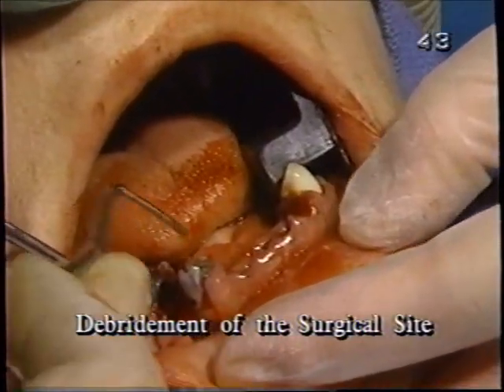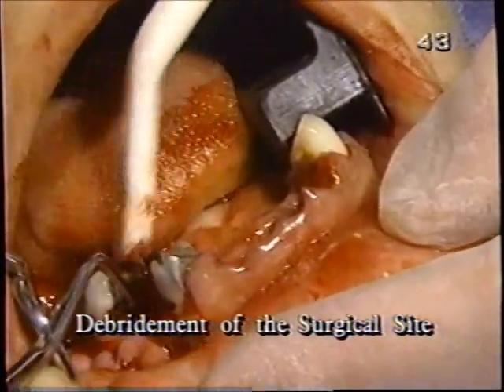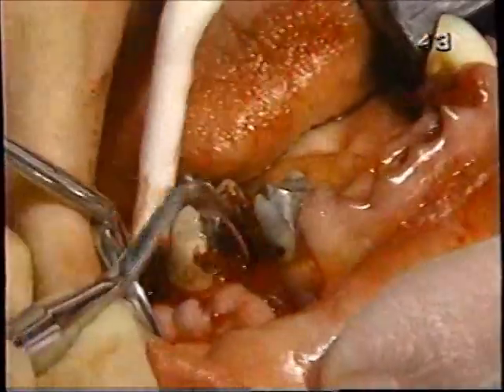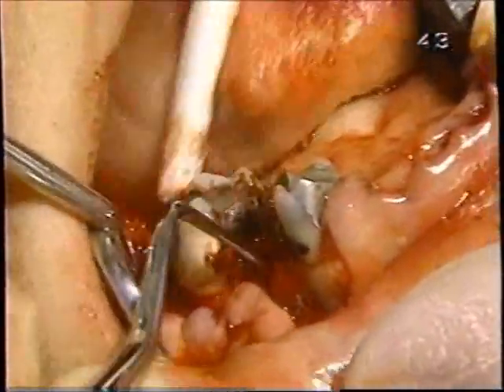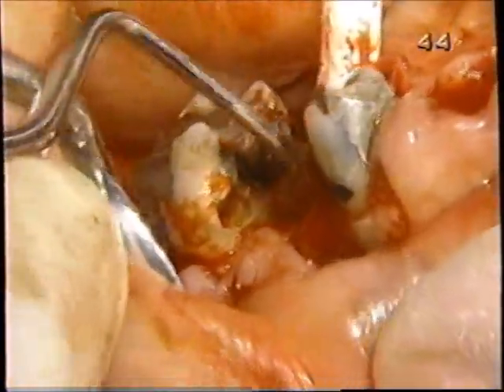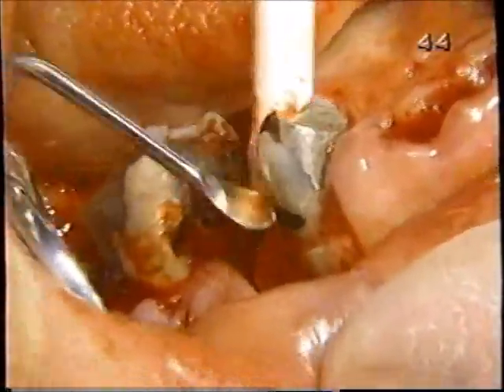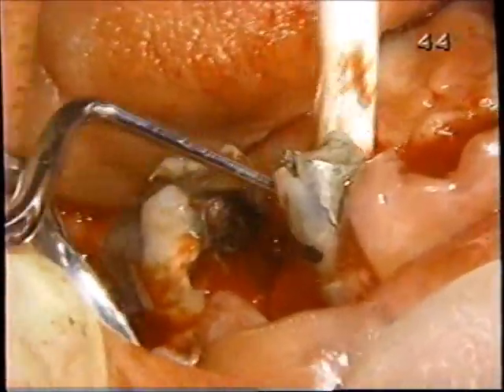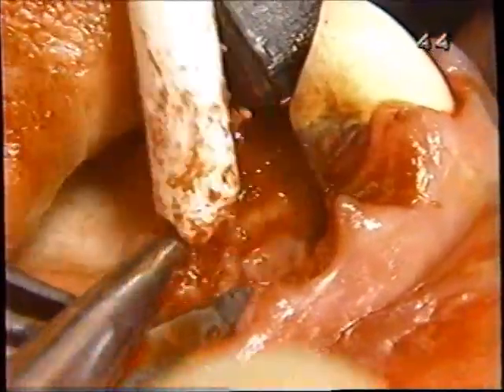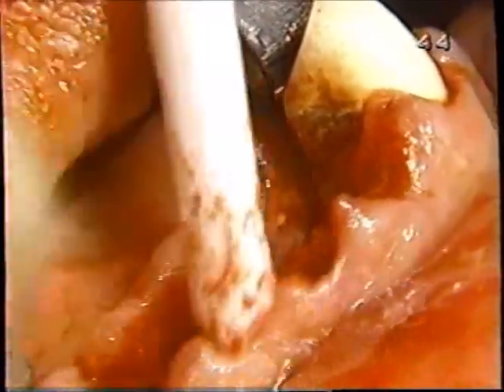First, let's remove some granulation tissue from this area. Now let's do the distal of that bicuspid. So important to get this out. Bur, particle.